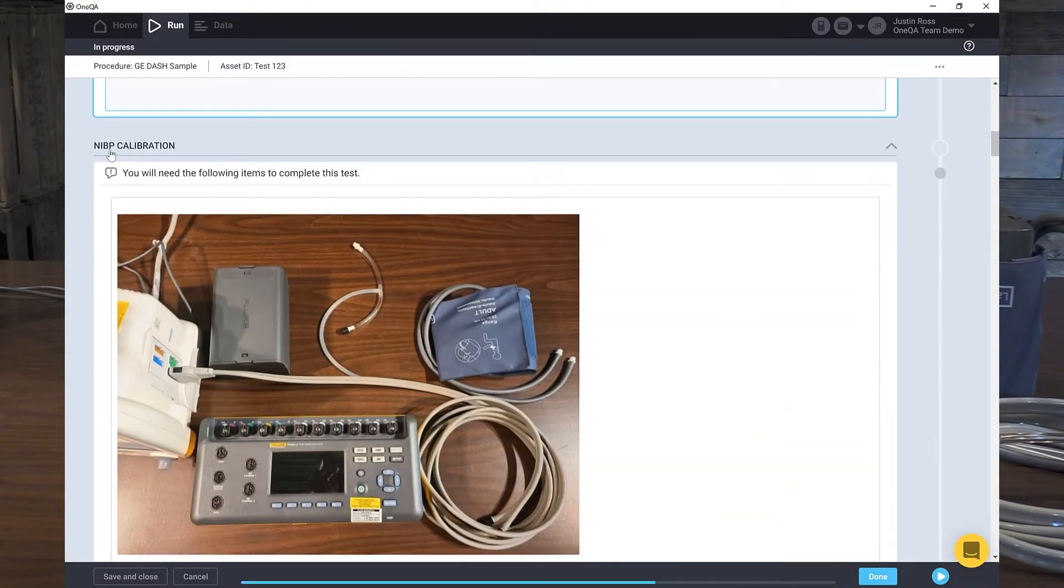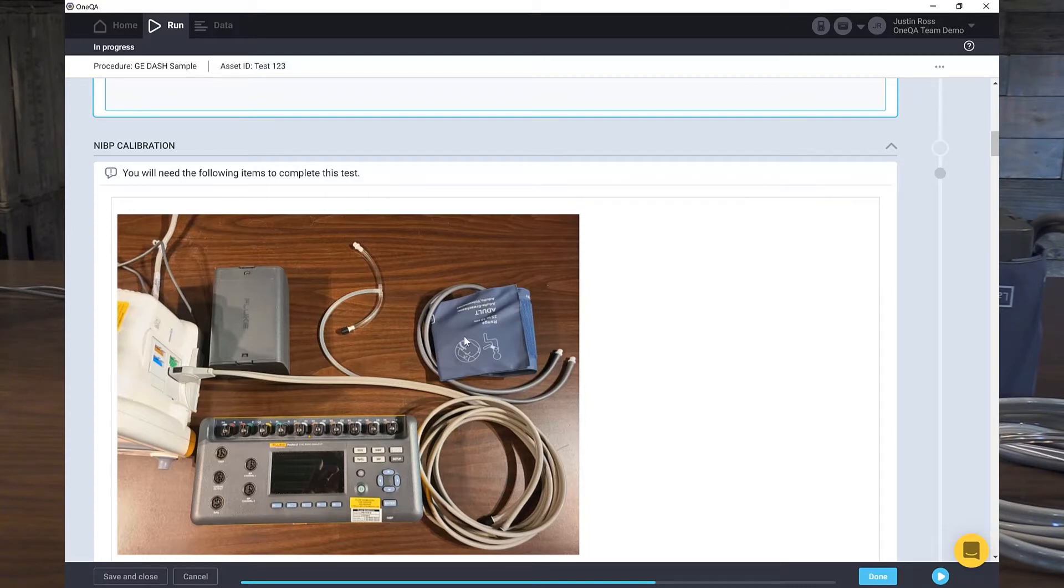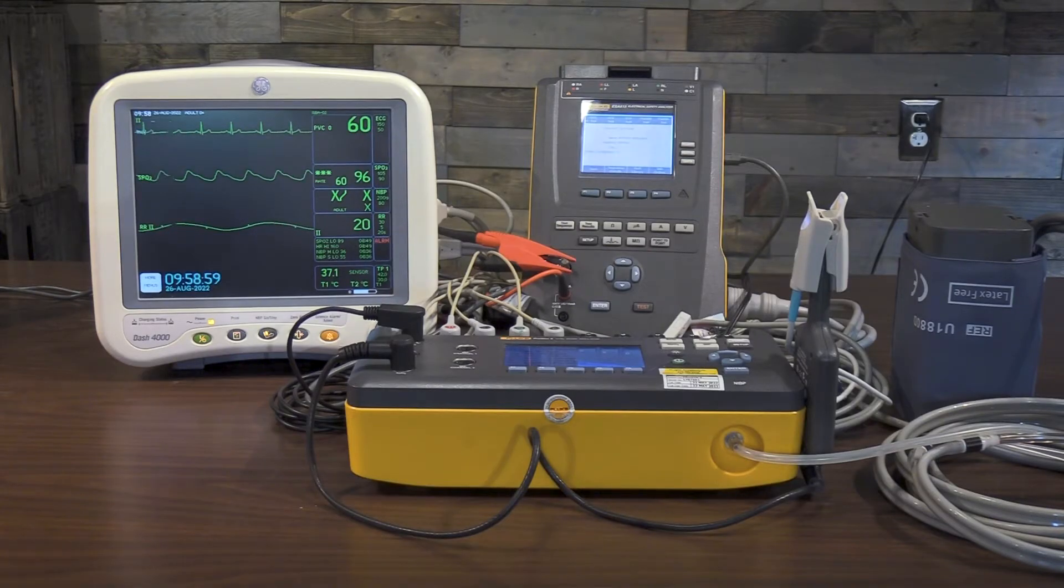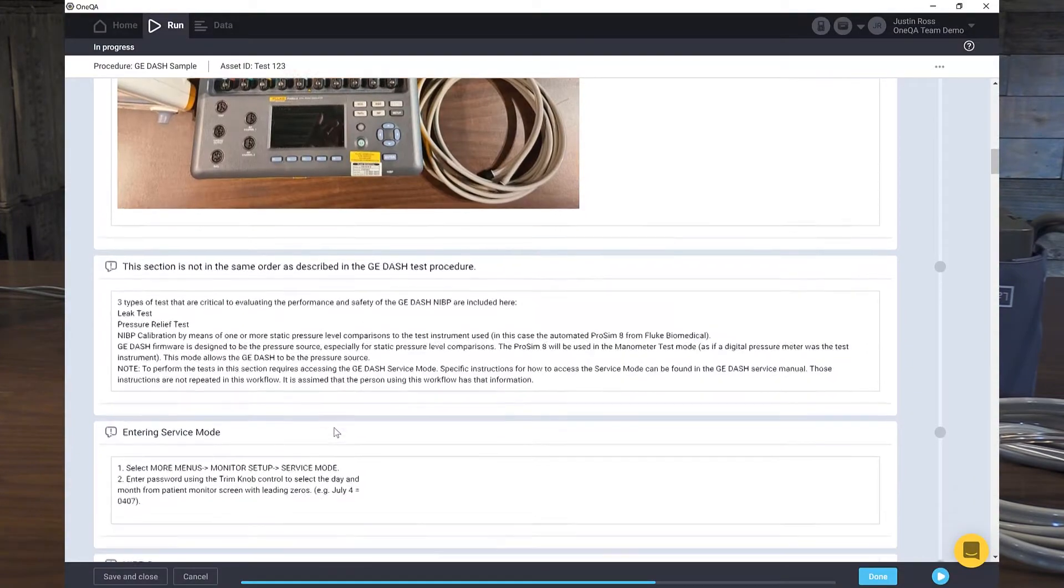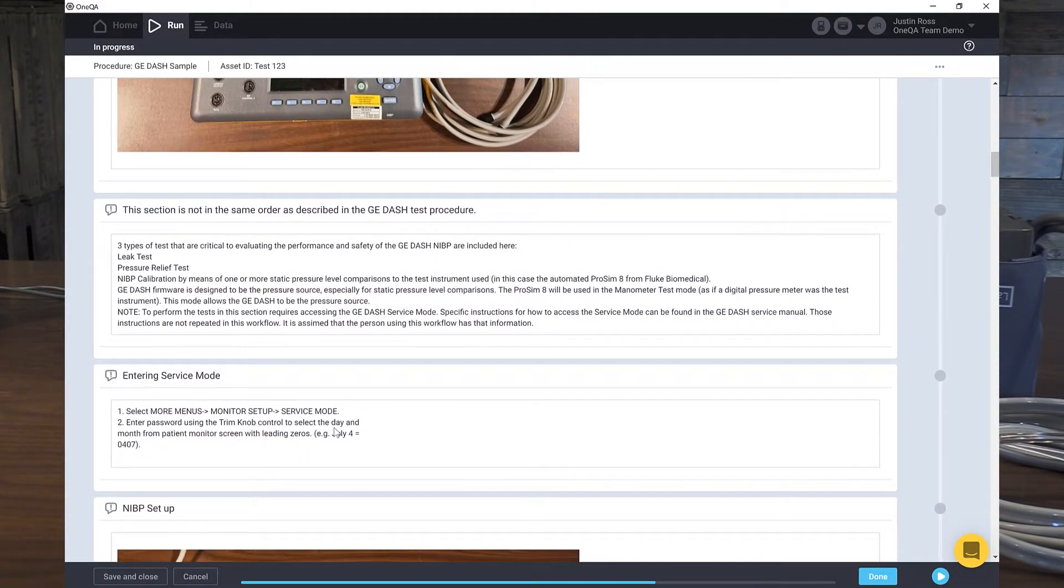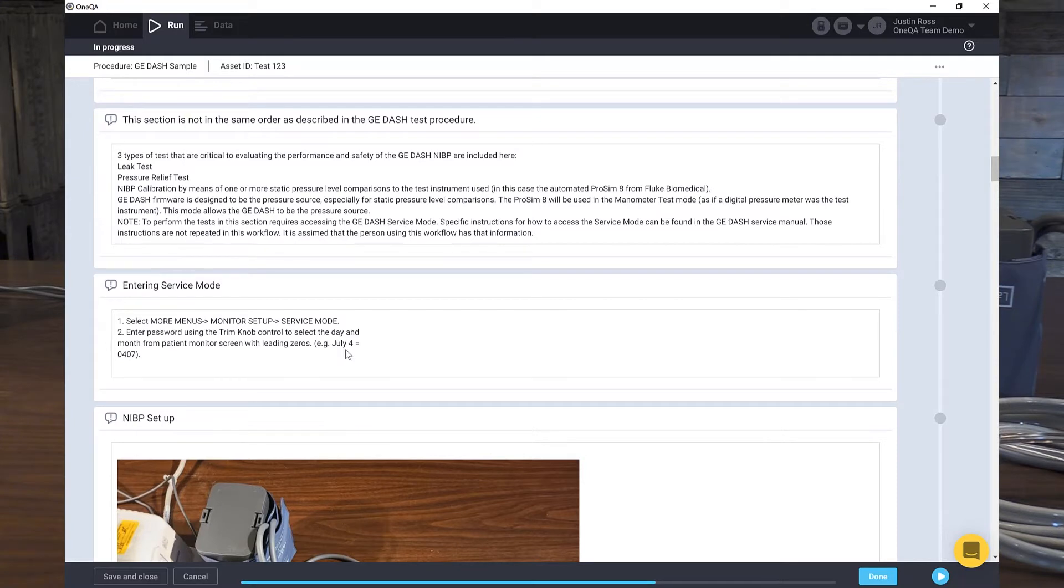Moving on to the next step. We're going to do a non-invasive blood pressure calibration. We'll need all these devices. We're going to need a mandrel for our Fluke ProSIM-8, the connector or adapter hose, the blood pressure cuff, the patient hose, and the ProSIM-8. So I have all those on the desk. They're already connected. Here's some special instructions we pulled out of the manual.